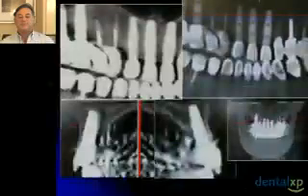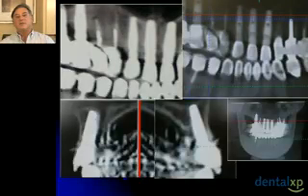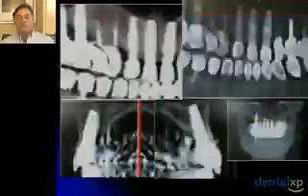patient. Here are some higher up views of that particular restoration, and you again see on the bottom left the cross-sectional views showing that the implants were placed into our triangle of bone. We preserved the labial plate, and we were able to have in this aesthetic zone confidence that we have excellent soft tissue thickness coupled with good positioning of our implants and not needing any customization of our prosthetic abutment forms.